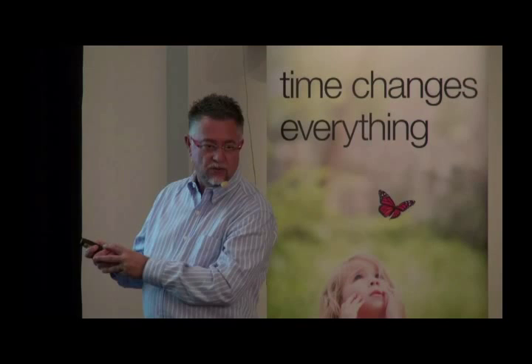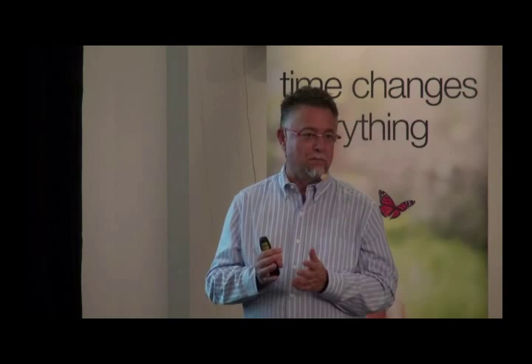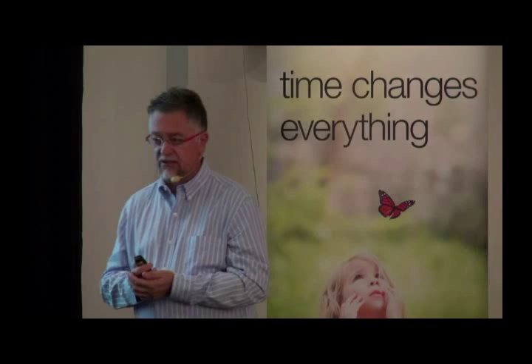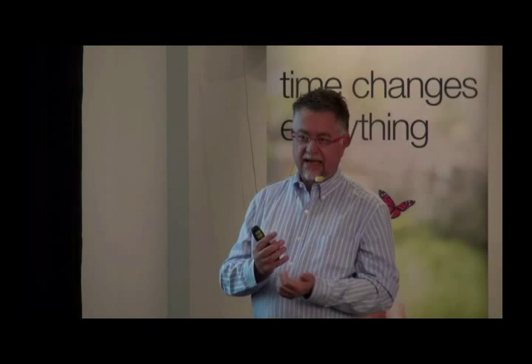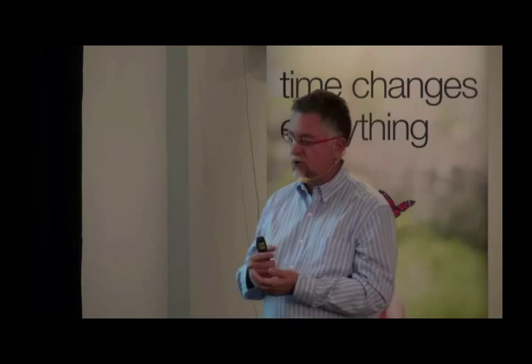If you ask me what is the best feature of the ProCyte in terms of day-to-day patient management in the clinic, and the one that has saved the most patients from bad stuff, it is for me the ability to detect bands and toxic cells. This software was developed at IDEXX, first in the horse and now for the dog and the cat and other species. It works so well that Sysmex, their partner company for the ProCyte, is now using that software for humans' left shift and toxic changes. So this is a great feature of the machine.